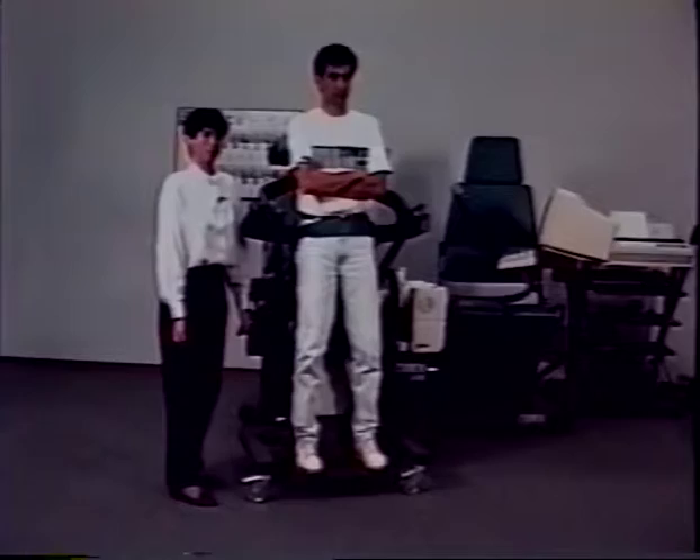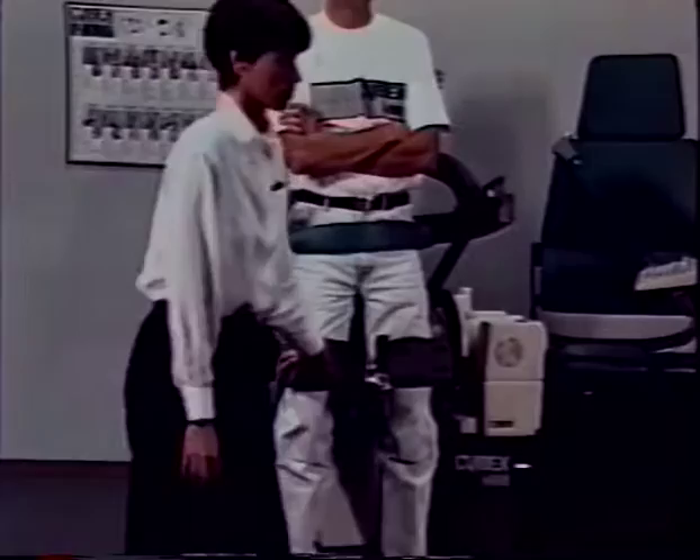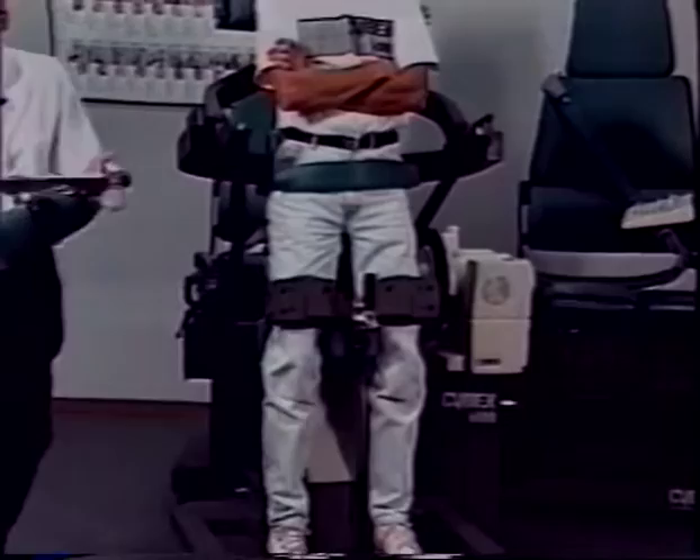To lock the lower extremities in place, first insert the thigh pad — the thigh pad goes in the upper tube. Push in on the thigh pad and push up on the lever to lock. Then insert the tibial pad — the tibial pad goes into the bottom tube. Push down on this lever to lock.